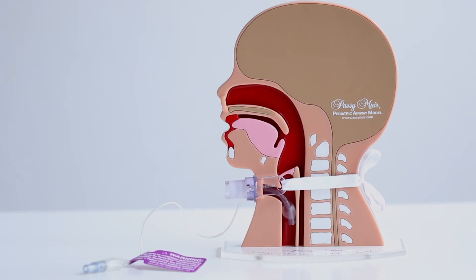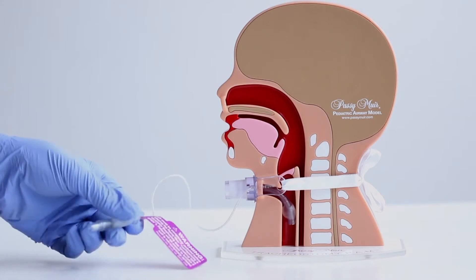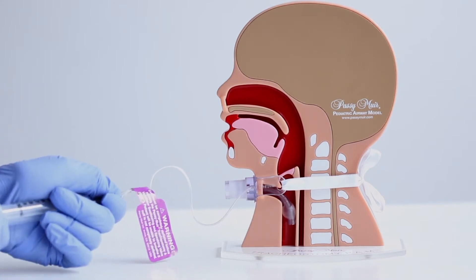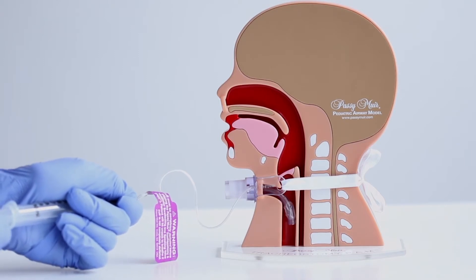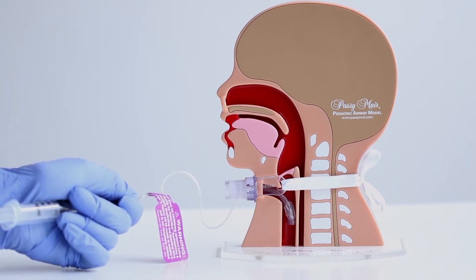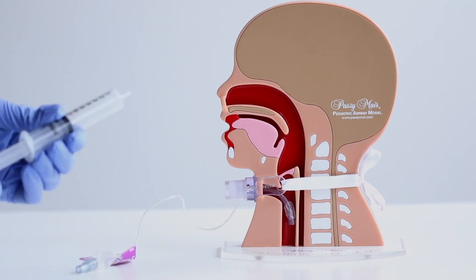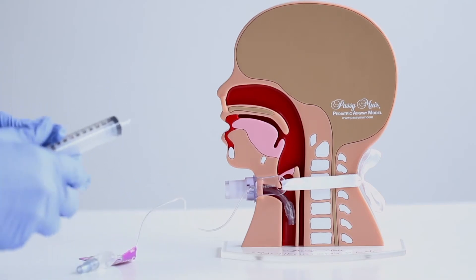Make sure the tip of the syringe stays securely inserted into the needle valve. Continue slowly pulling back on the plunger until resistance is met. At this point, the pilot balloon should now appear empty and flat. Next, remove the syringe.